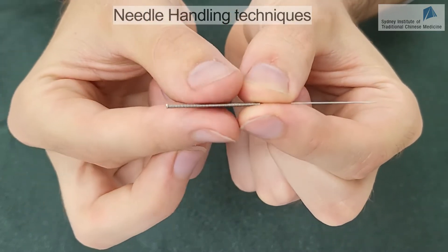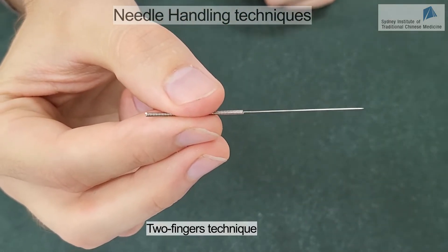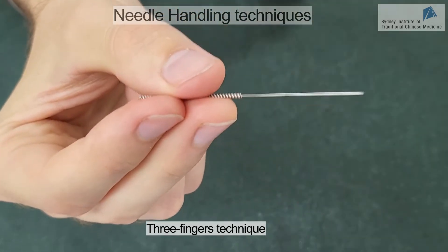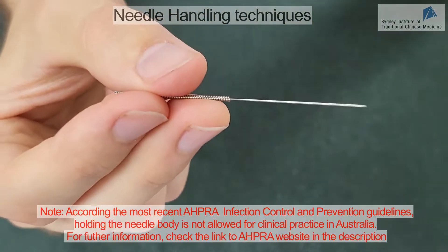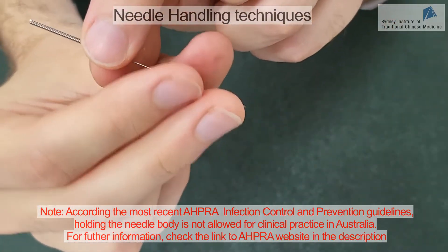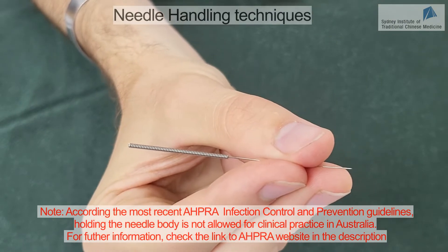Generally, we hold the needle between the thumb and the index finger. Some people like to use three fingers. Traditionally, some acupuncturists hold the needles at the body directly, but this is rarely used nowadays.